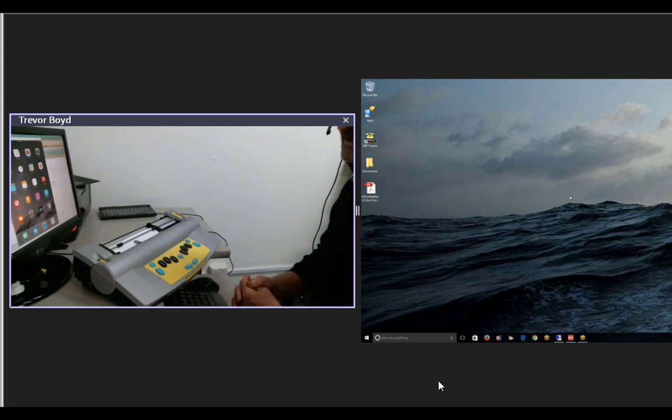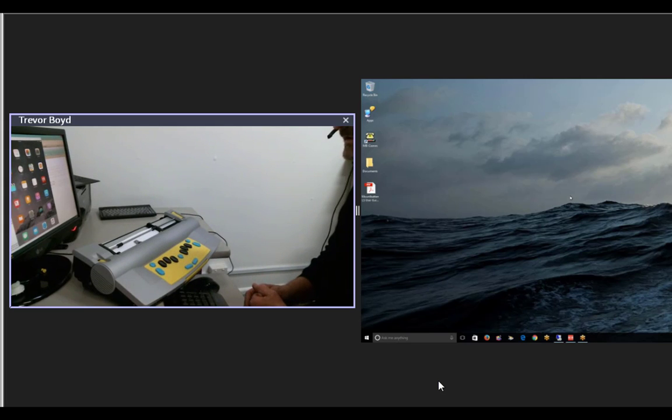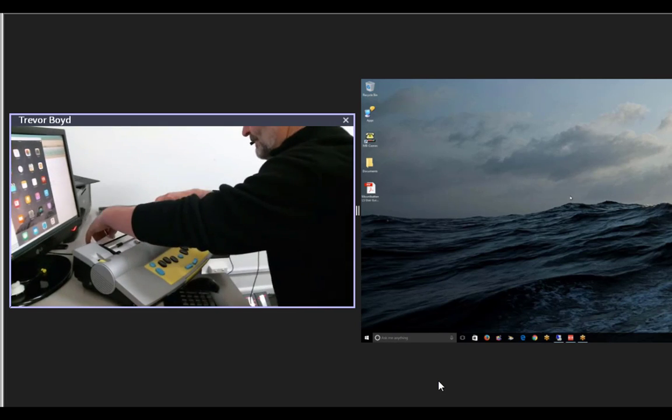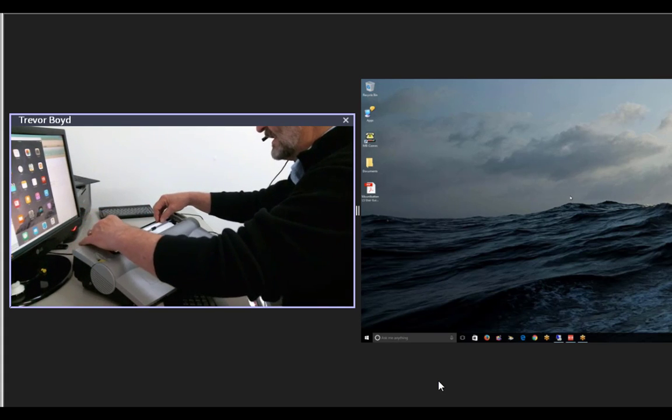And the synthesized speech will generate letters, words, sentences, whatever's needed at the time. So that's a big advantage when students start to learn their contractions. So they might actually braille a B, but it will say "but". C, "can", D, "do". So it says the contractions. So again, it's very useful for students who are learning those contractions. And there's actually a training scheme inside the Mountbatten to allow you to do that.